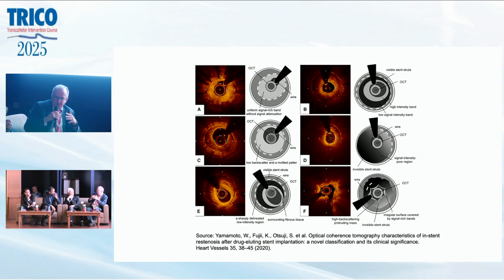My approach to calcium has just generally been rotablator, and IVUS with the appropriate anatomy in terms of length. And as I look at these, I realize I have a lot to learn about OCT. But I'm also pleased to hear that you were hesitant in some of these.